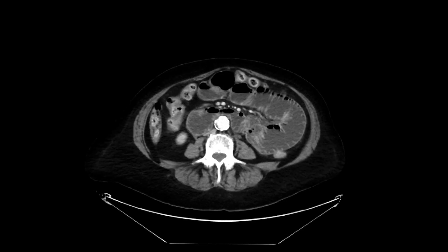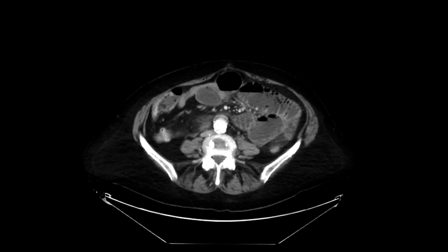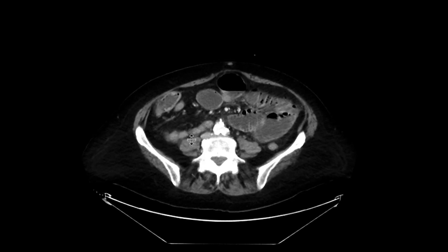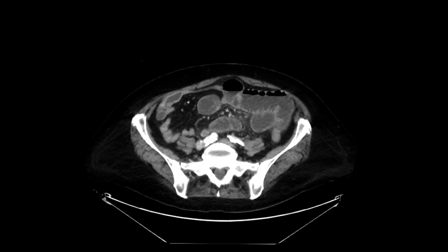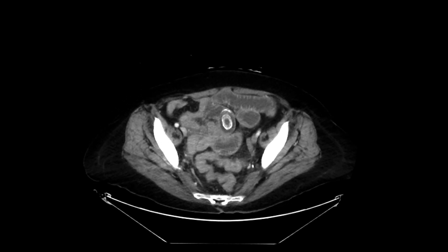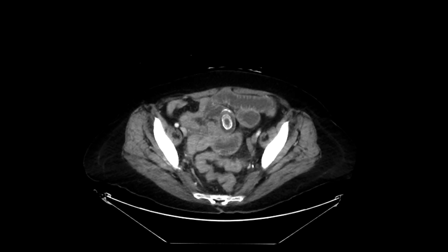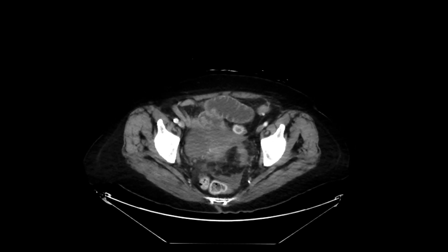As we scroll more downwards, we can see that there's numerous distended loops of small bowel, and there's some collapsed loops more distally. So there's a small bowel obstruction. As we scroll even lower down, we can see right in the pelvis there's a large calcified structure within one of these distended loops of small bowel.